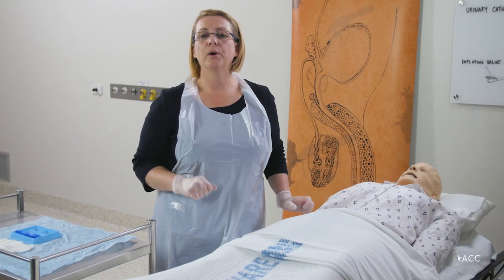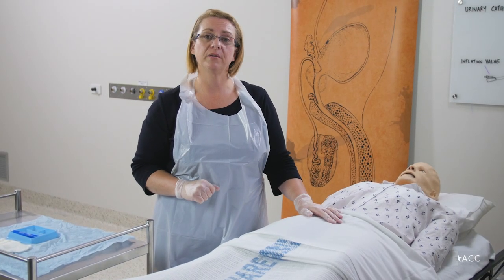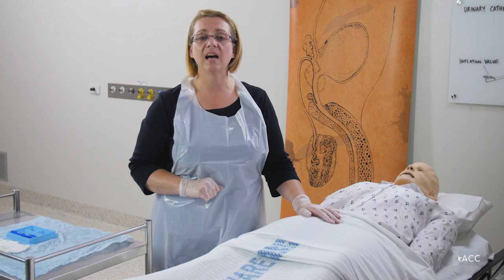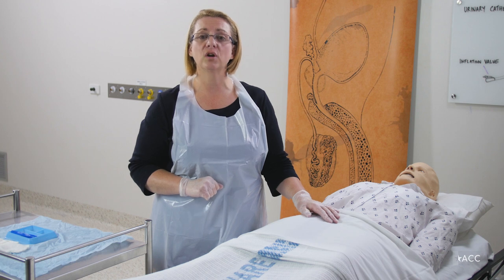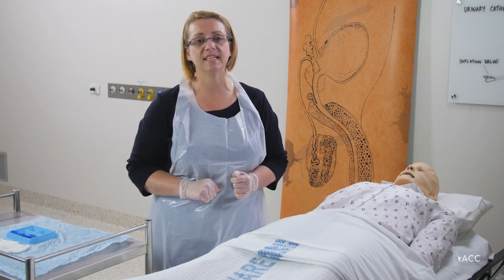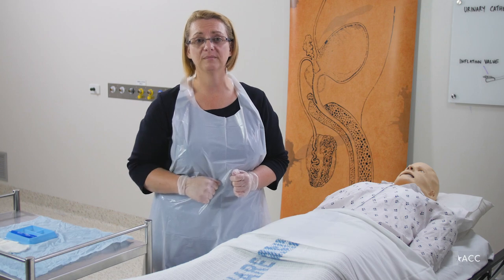By following the correct procedures for changing urinary catheters and recognising how to monitor and troubleshoot, you can help preserve the comfort and dignity of the person in your care.